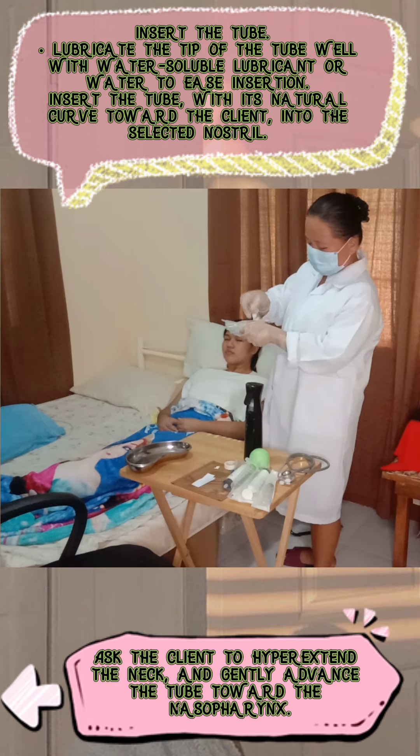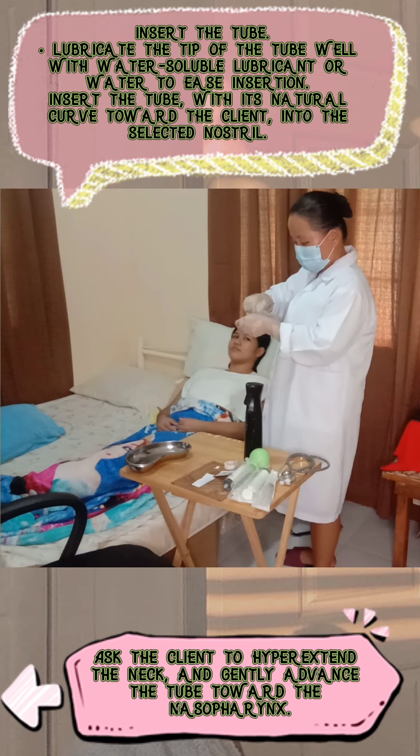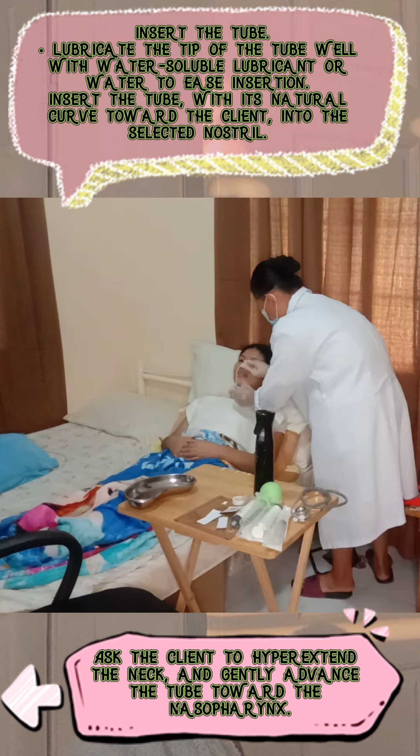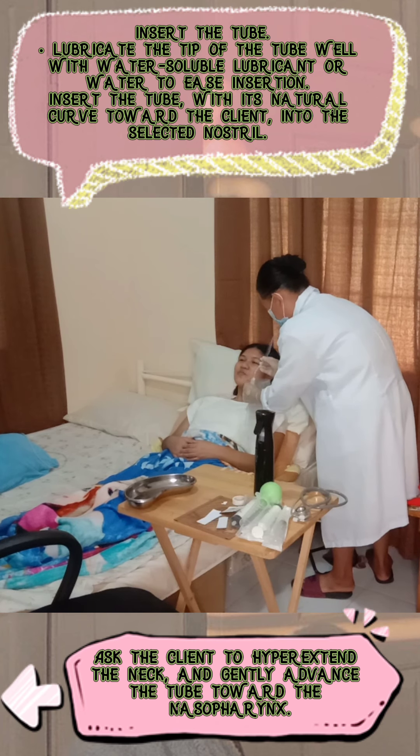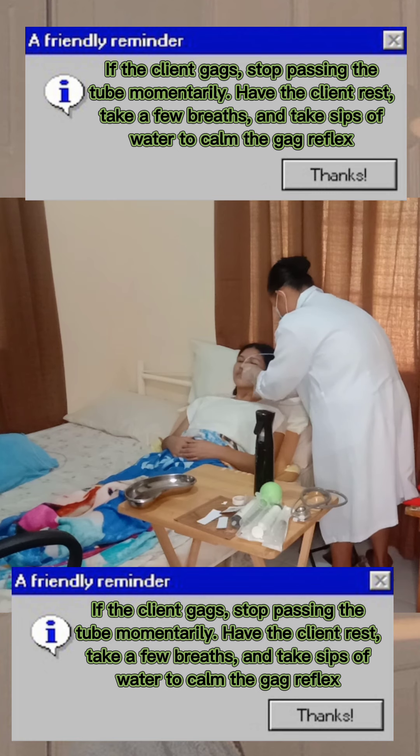To insert the tube, first lubricate the tip of the tube well with water-soluble lubricant or water to ease insertion. Insert the tube with its natural curve toward the client into the selected nostril. Ask the client to hyperextend the neck and gently advance the tube toward the nasopharynx. If the client gags, stop passing the tube momentarily, have the client rest, take a few breaths, and take a sip of water to calm the gag reflex.